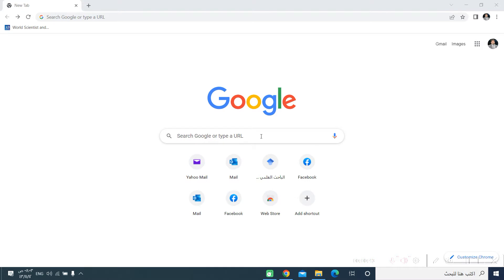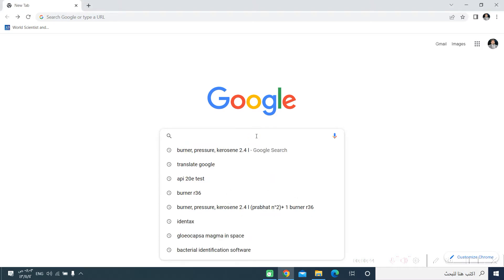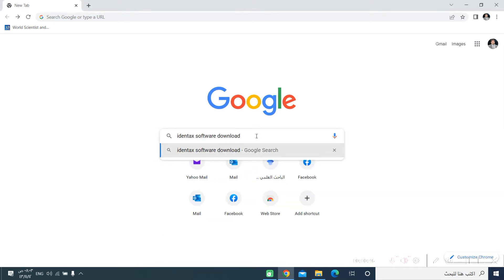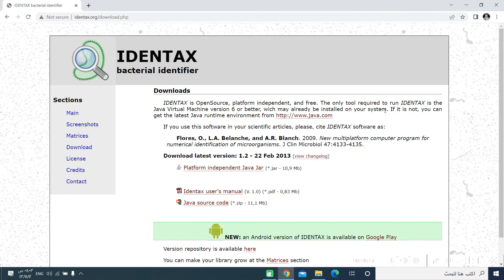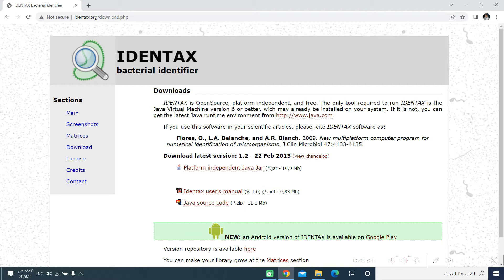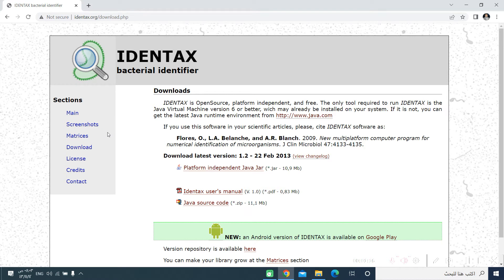Let us start by searching for the website by typing in IDENTAX software download. Usually it will be the first page in the Google search. We will click. This page will show us many features of the IDENTAX Bacterial Identifier software, one of them is the download area and the other is the matrices, in addition to screenshots and many other information that can be useful to you.